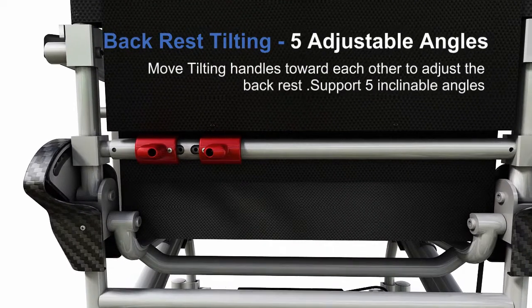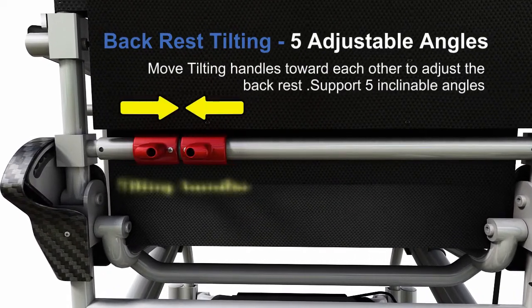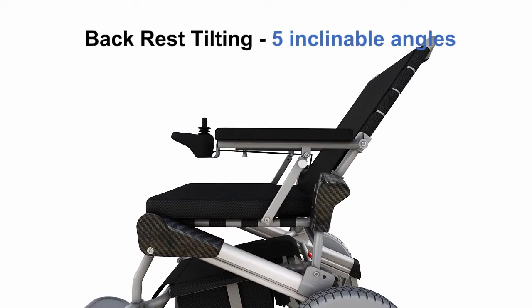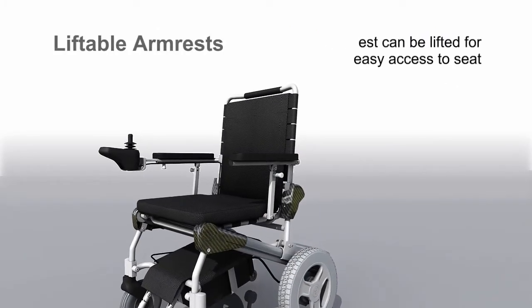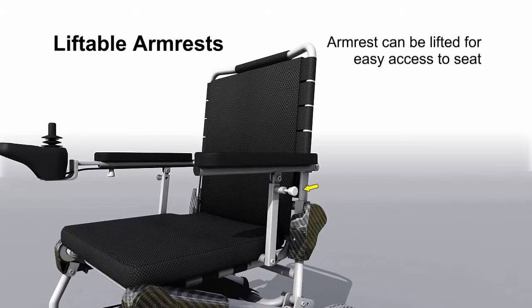Backrest tilting with 5 adjustable angles — move the tilting handles toward each other to adjust the backrest, supporting 5 inclinable angles. The armrest can be lifted for easy access to the seat.